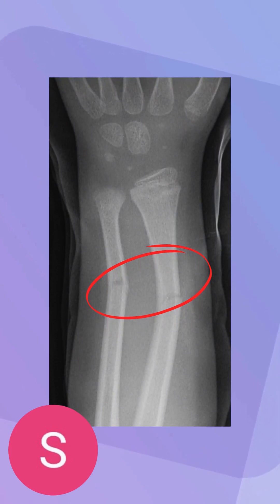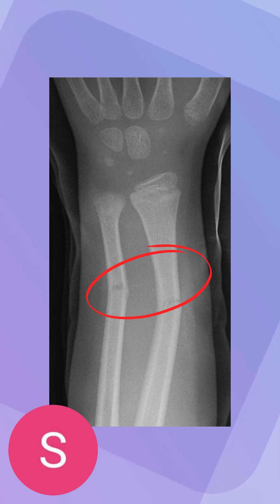So, this is a type of fracture. I want you guys to take like five seconds, kind of look at the fracture itself, which is in the red circle by the way, and kind of think to yourself if you've ever seen or heard of it — and it's referred to as a greenstick fracture.